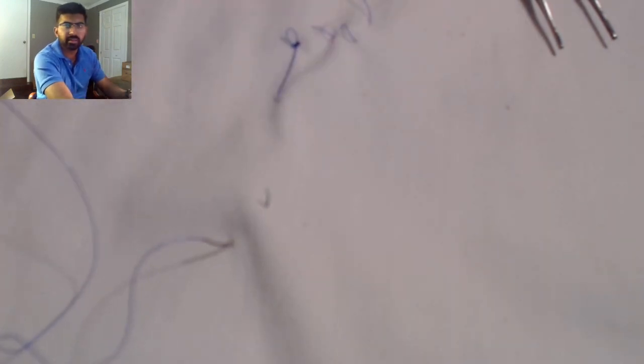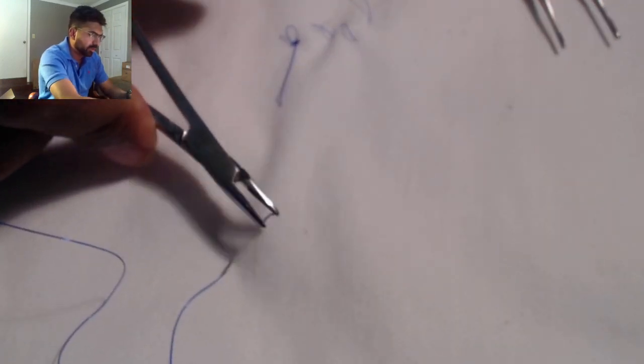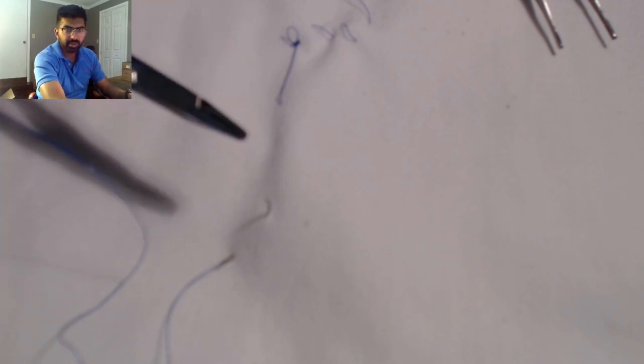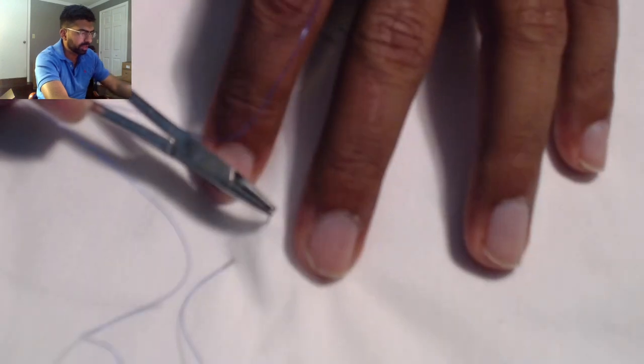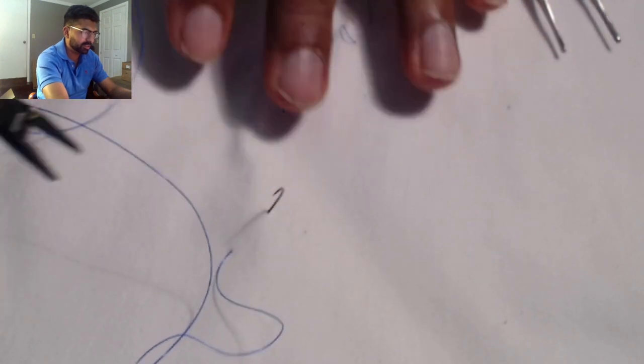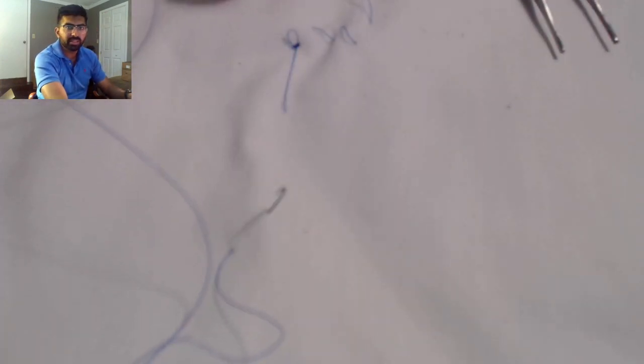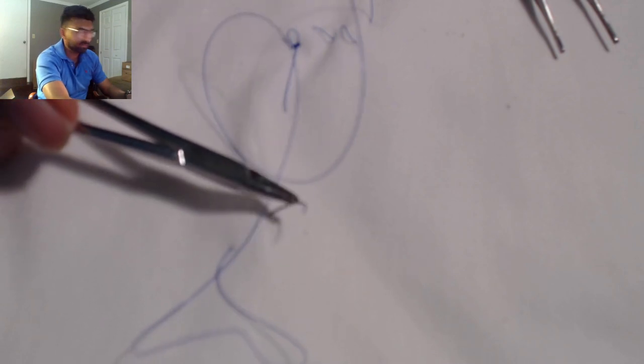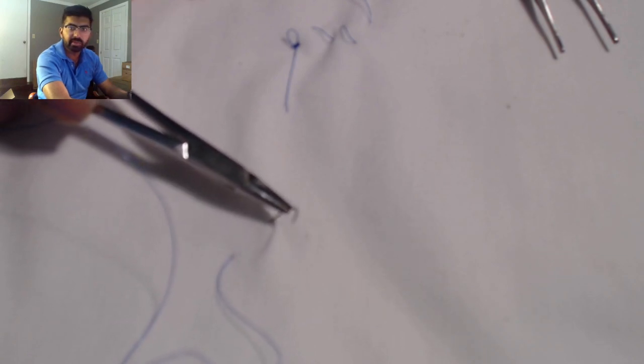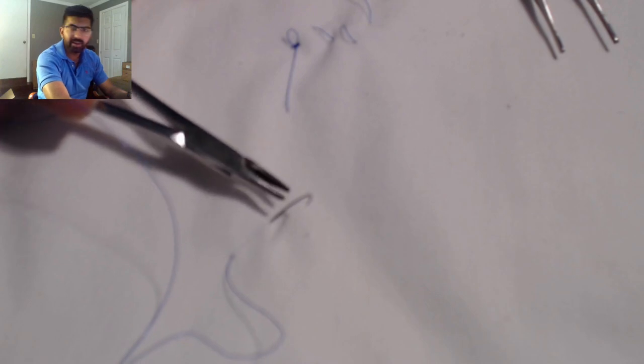You take any bite in the tissue. Now this is where most people find it challenging, but we'll go over it step by step. The needle right now is inside the tissue. We're going to pronate our hand and rotate it so that about 75 percent of the needle is still sticking in the tissue. The 75 percent mark is actually inside the tissue, and I'm going to grab at the 50 percent mark of the needle.